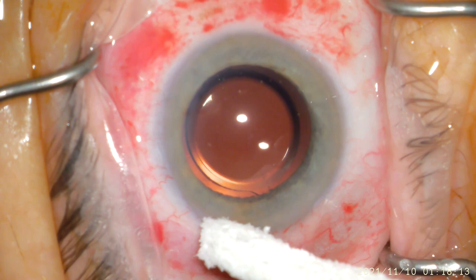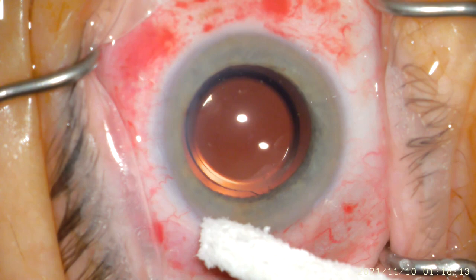Now all of the incisions have been checked for a watertight closure, and we have introduced a little bit of intraocular antibiotic to greatly reduce the chance of infection after surgery. The surgery is now complete.